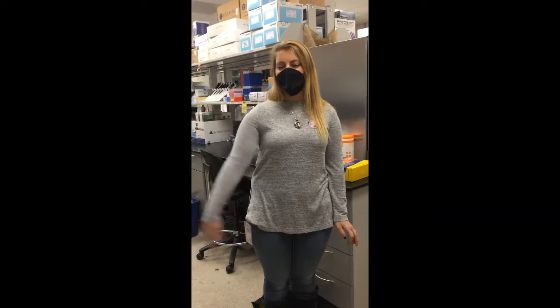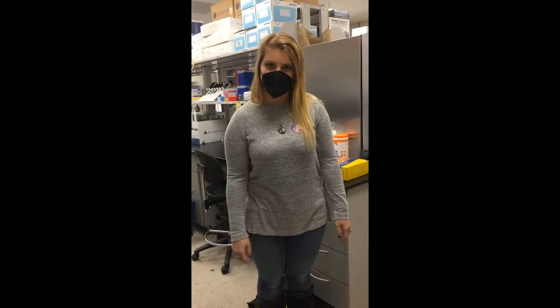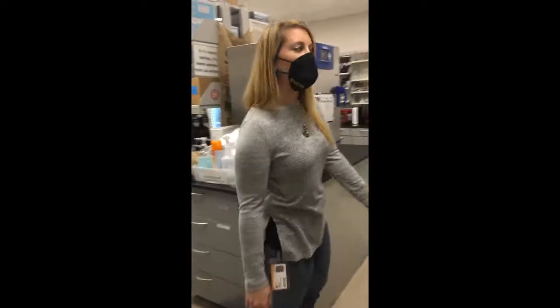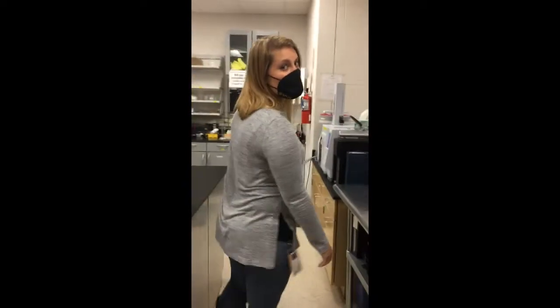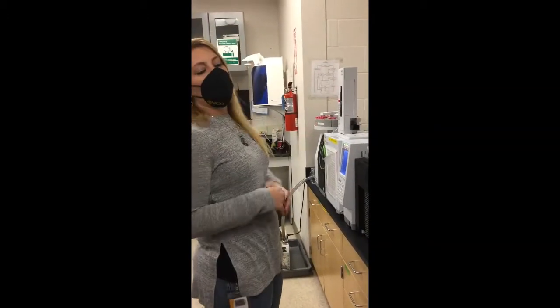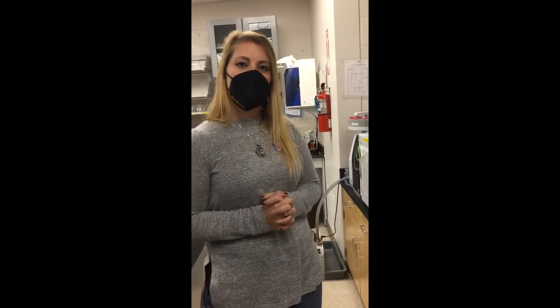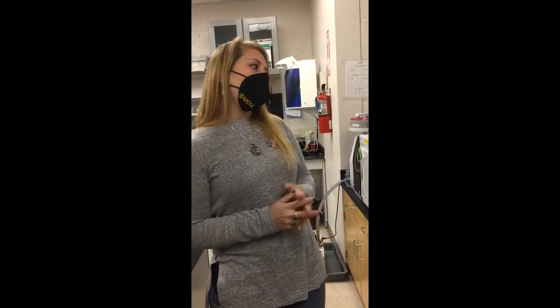Hi, welcome to the lab for Forensic Toxicology Research here at VCU. I'm just going to give you a brief tour around the lab so you can see all of the instruments that we are fortunate enough to work with. So this is our GCMS. We use it for pretty much all kinds of screening methods. We look at e-liquids to determine their chemical constituents. We've evaluated real-life samples that people have sent in after poisonings.